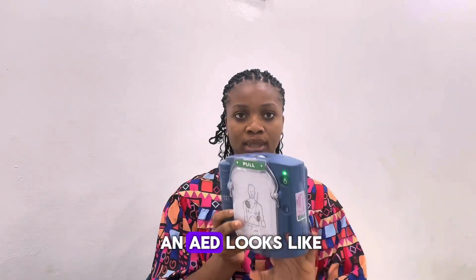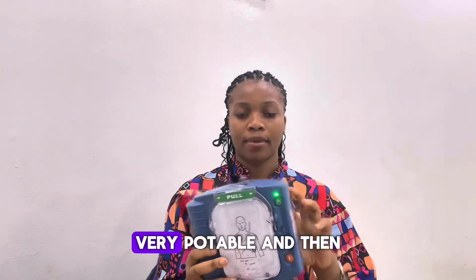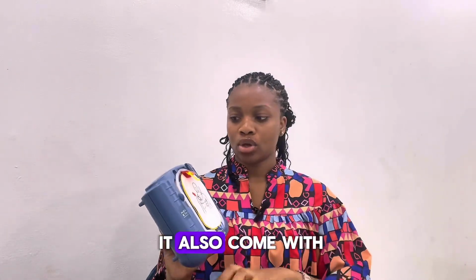This is what an AED looks like. Very portable. And then it also comes with a pad. That is two pads.